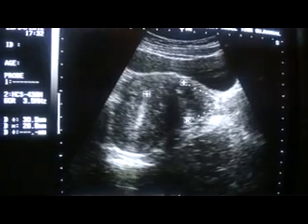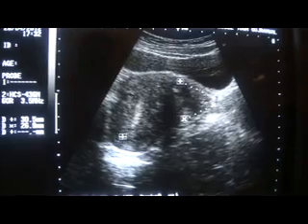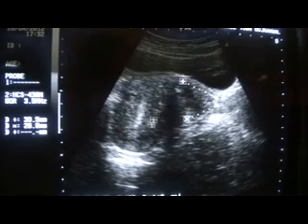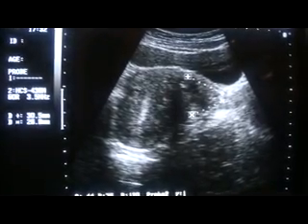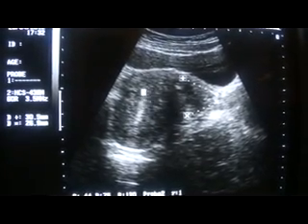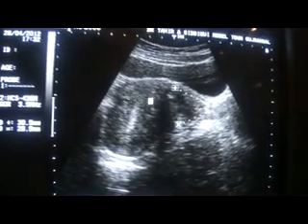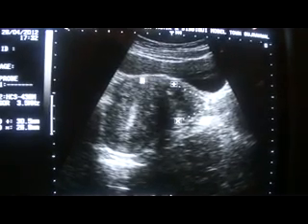So this is a case of a retroverted uterus. In such a uterus, when you move the probe 90 degrees and scan in transverse section, most people who are not fully trained in ultrasonography will label this area as a fibroid or a focal mass in the uterus. When I move the probe 90 degrees — easily you can say this is a fibroid, this is a mass — but this is not a mass; this is basically the fundal region.